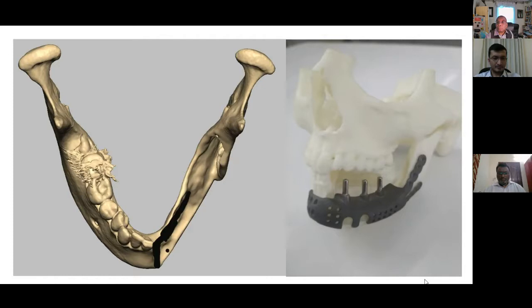So everything went into the prosthetic design with 35% of tissue shrinkage vertically, and what pushed me to think of this design is the pathology. The nature of the pathology was slightly less aggressive than the previous one, and there is always a possibility to preserve the natural bone, at least on the lingual side in this particular case. And teeth anyway have to go.